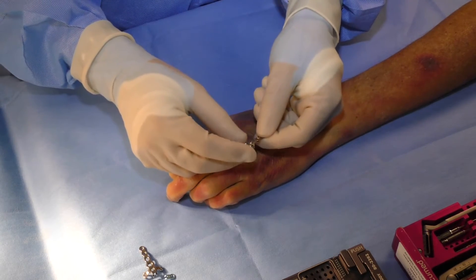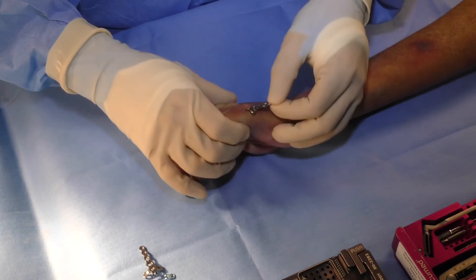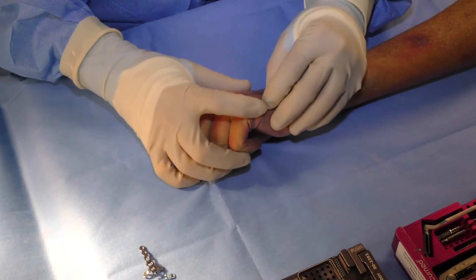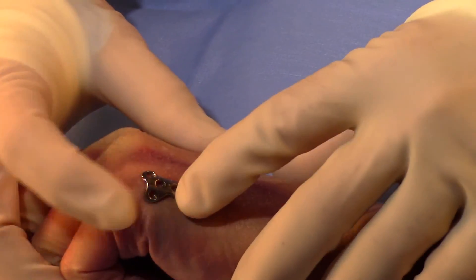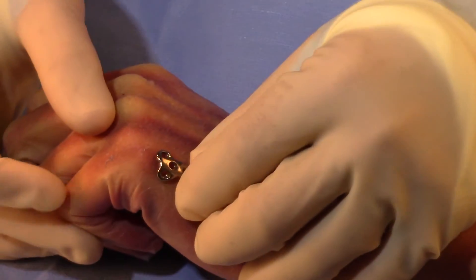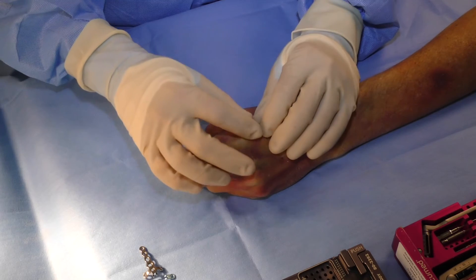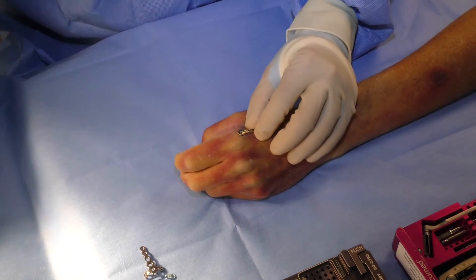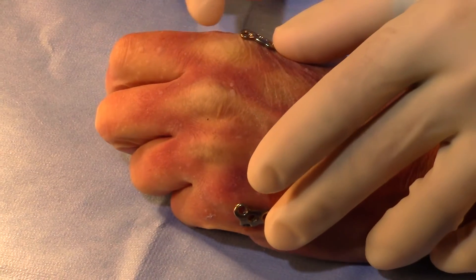The boxer fracture plate is designed to stabilize a fracture of the neck of the metacarpal, most commonly occurring on the small finger. This plate has a left and a right side. The left-sided plate sits alongside the metacarpal of the small finger, fixated on the dorsal ulnar side, with screws angled distally so the plate does not impinge on the extensor hood and does not block flexion. For an index finger metacarpal neck fracture, the right-sided plate would be used. So the left-sided plate is used for the left small finger metacarpal, and the right-sided plate for the left index finger metacarpal.